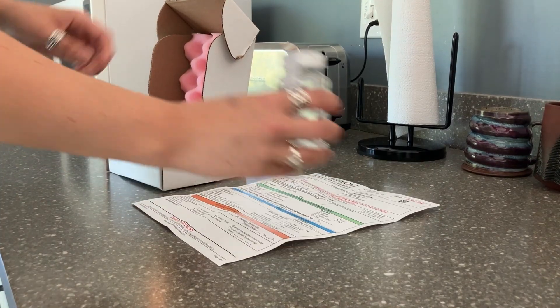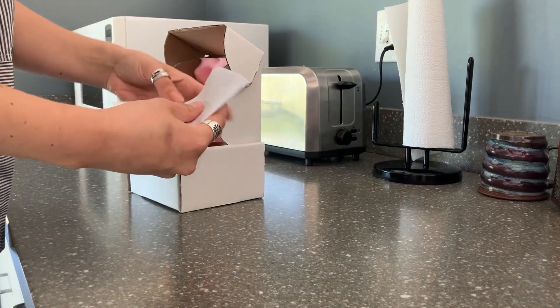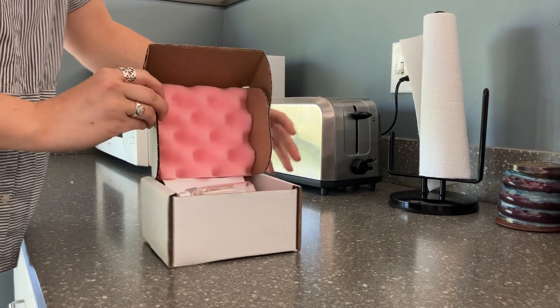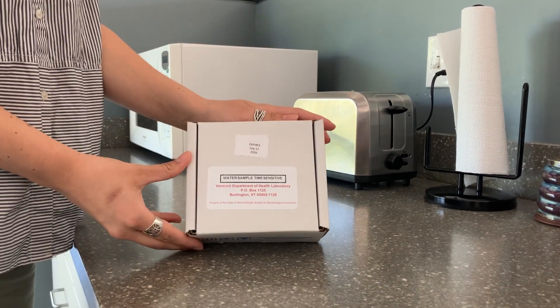Now that your sample is collected and packaged, you can return your sample to the lab. Your sample needs to be tested within 30 hours of being collected. You can find a list of sample drop-off times and locations with your sample return instructions in the kit.